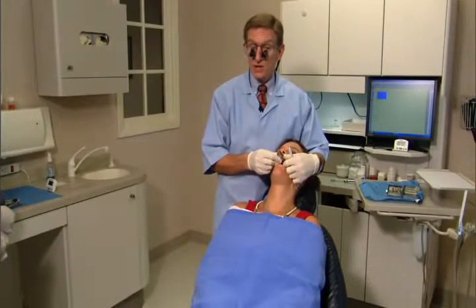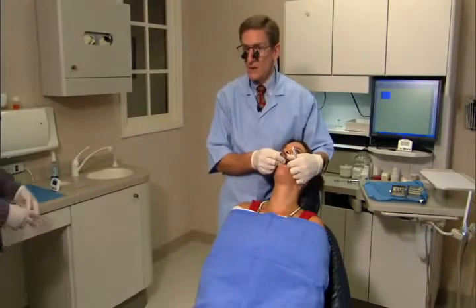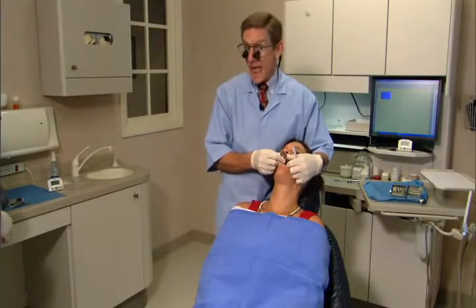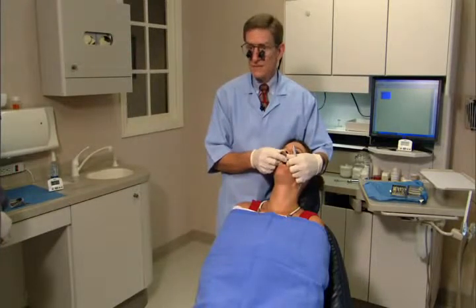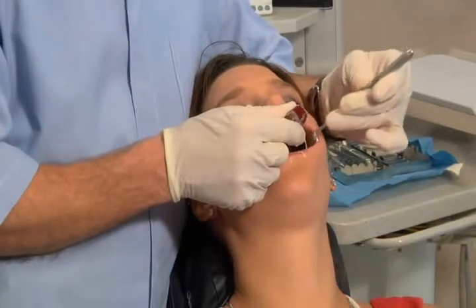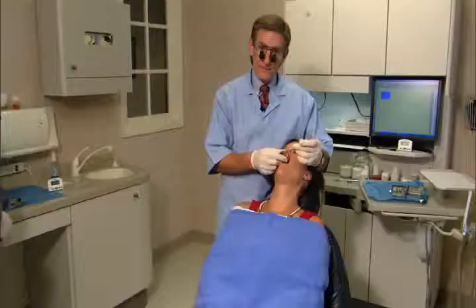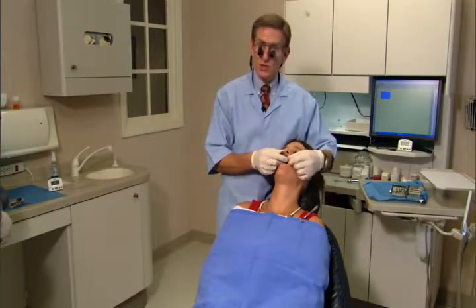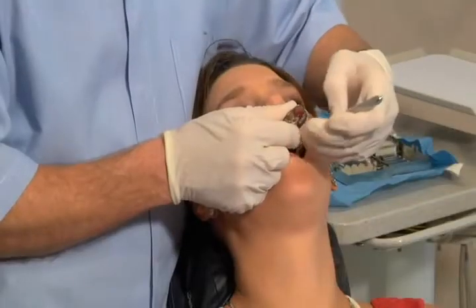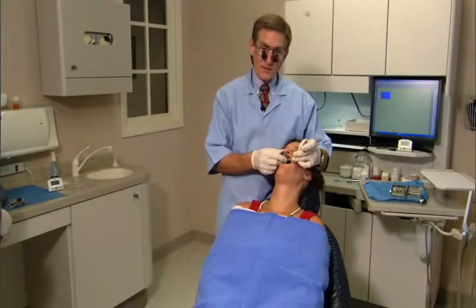You don't have to get patients to pull their feet up or throw salt down their throat. You can turn and say, looking at the timer, 'We've only got 47 seconds left' — right then the patient can stop panicking if they feel they can't breathe. I used this mirror when putting the tray in, when trying trays, and I'll use it removing the tray. If you're by yourself, lay the mirror on the patient's shoulder, mix your material, put it in the tray, and pick up the mirror to insert it. This one step will make your life a whole lot easier.